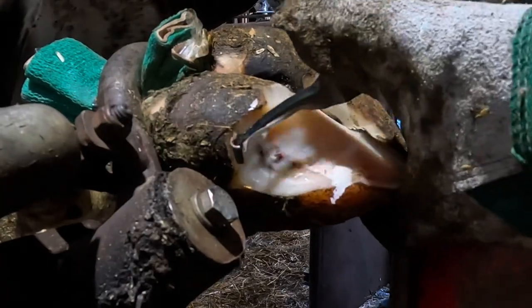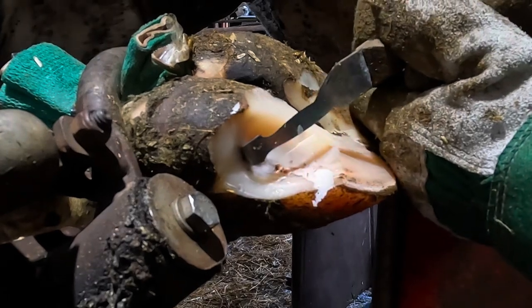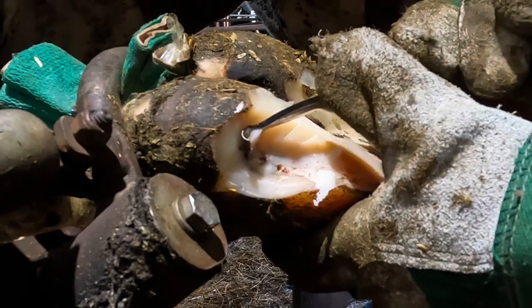My job now is to get all the loose horn from around the lesion cleared away. That's going to allow that lesion to heal, and it's also going to allow that white line to form correctly again.